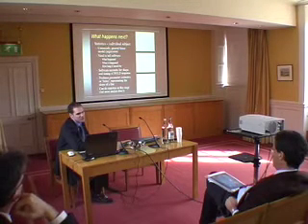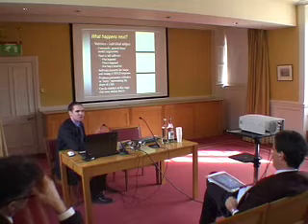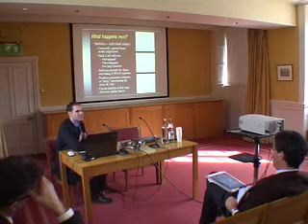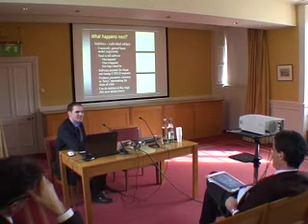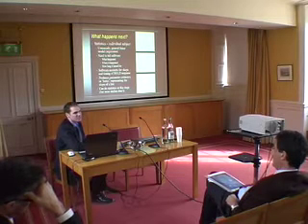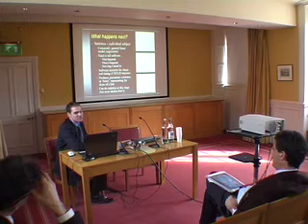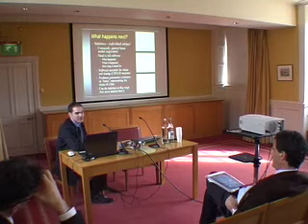When we come to do the group studies, what we have to do is take some kind of statistic that is a summary of the response for each of the individual subjects. But unfortunately, that turns out to be very, very complicated. So the summary statistic that people take are what are called betas, or parameter estimates, which is the same as saying the slope of that line.